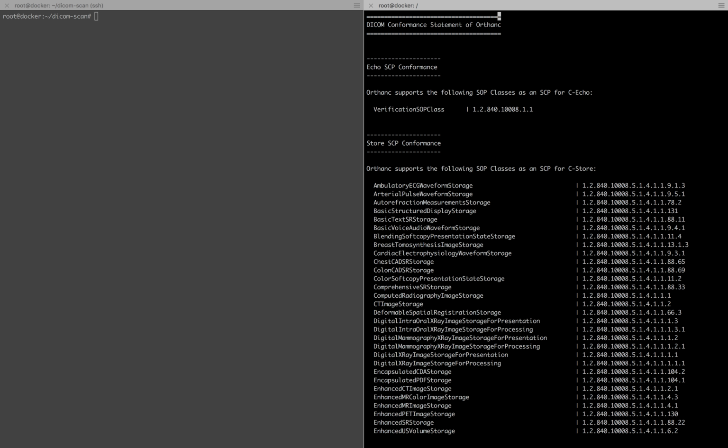I don't know if that research came out before or after I started reading through the DICOM toolkit and the Orthanc code, and the PyNetDICOM code. But one of the commonalities between their research and my research is looking through PyNetDICOM. I actually use PyNetDICOM for DICOM-Scanner, and will continue to use it as I'm doing more and more things against DICOM in my research.